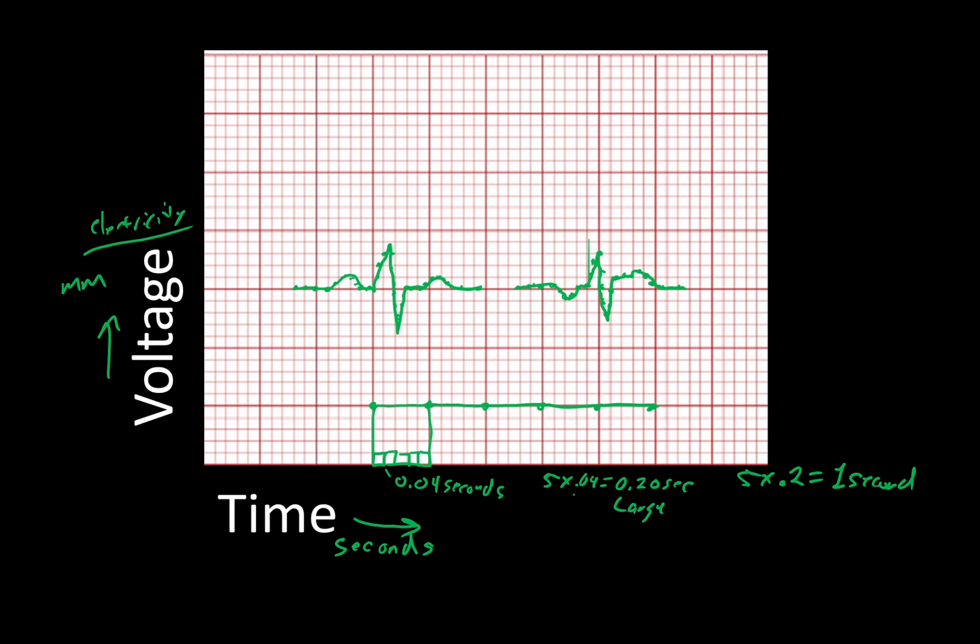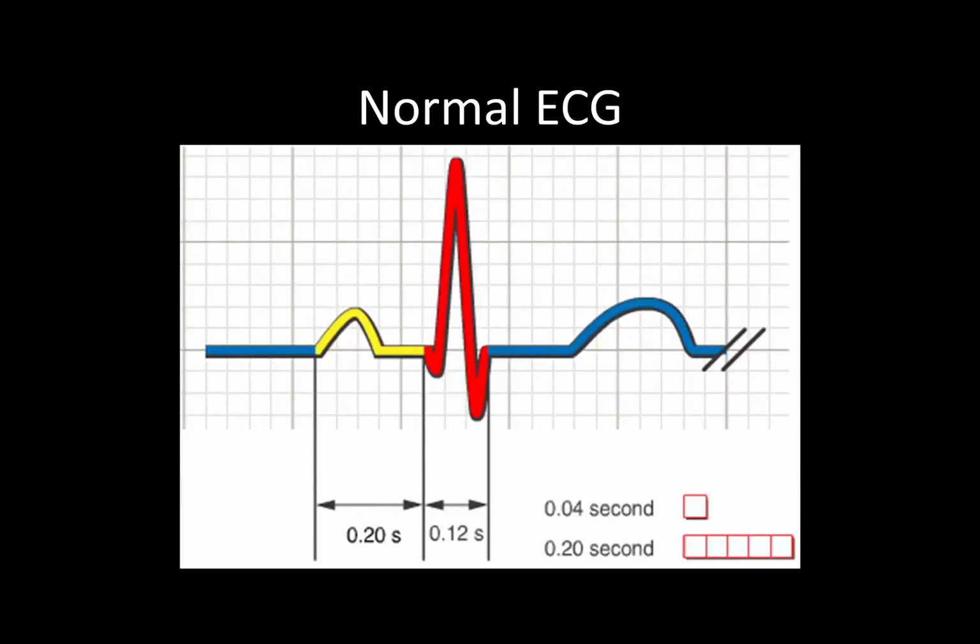So let's find out some names for all of these waves. Okay, so this is a basic standard EKG complex as seen from lead 2.